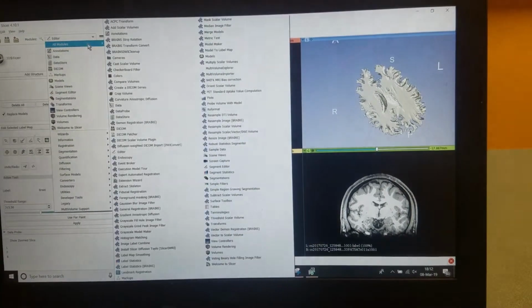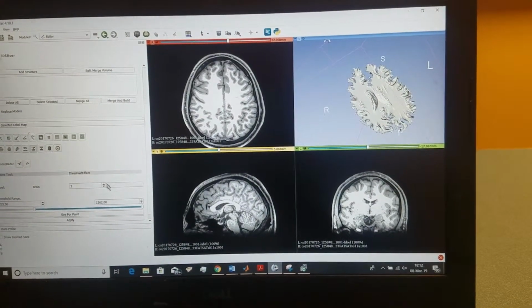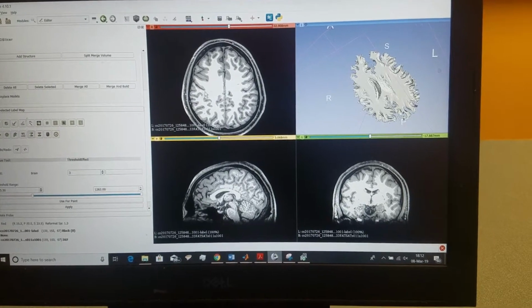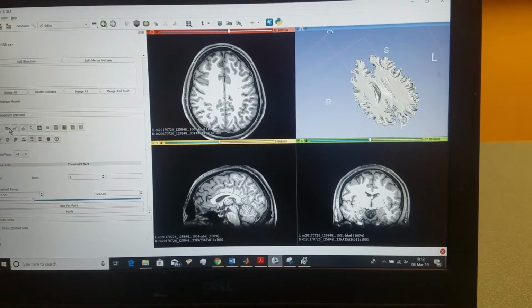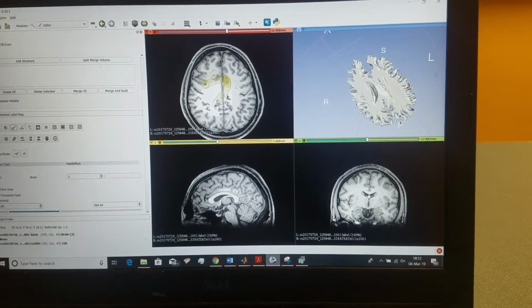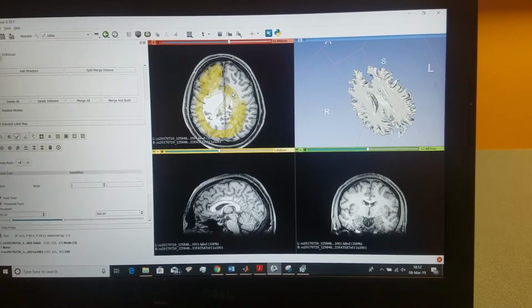So what we did was we go to all modules and editor, we come to this page, and then using the threshold tool, we're able to set a number of pixel values that are going to illuminate a certain region. And then you can also use the draw tool here, and if you go over it like this, it'll fill in anything that was within the threshold, so you don't have to get anything that was wrong.